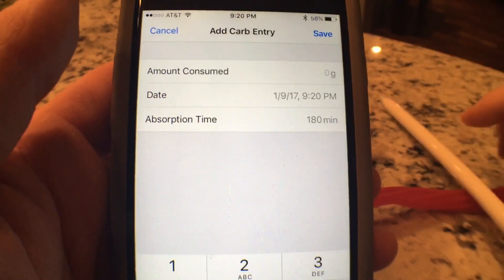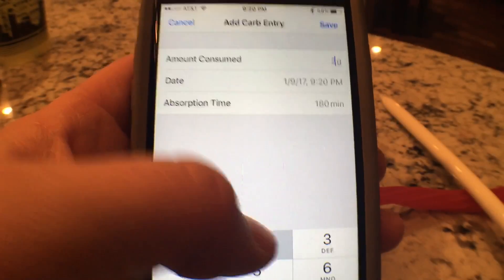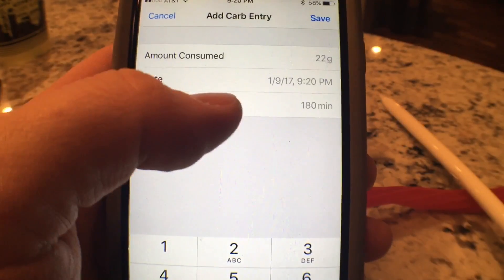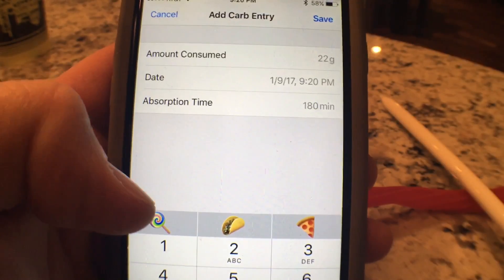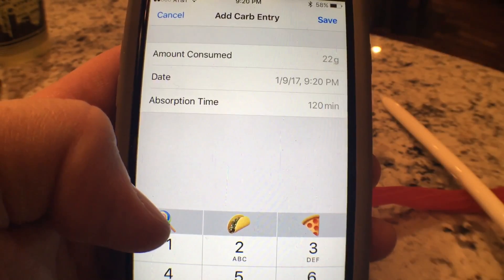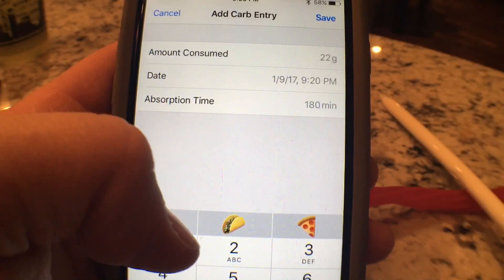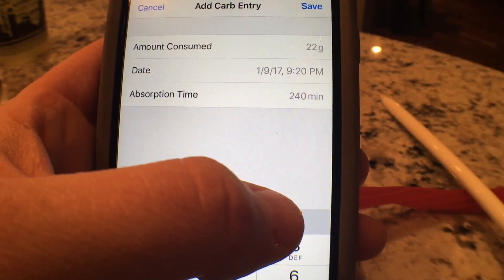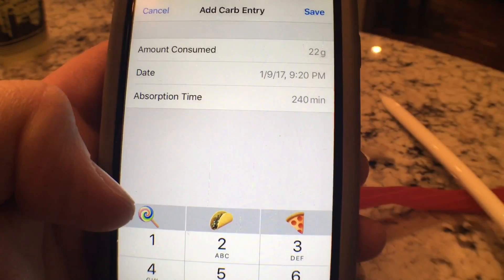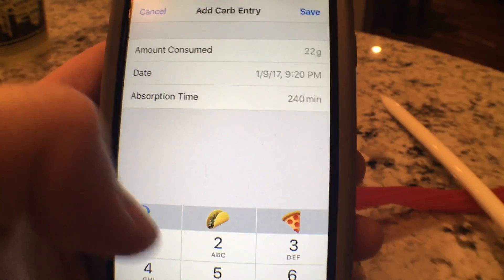This is where you enter carbohydrates. If I said I ate 22 grams of carbohydrates but I wanted to change the absorption time, you can say here's how long these carbs are going to be in your body. This is basically two hours, this is three hours, and that is four hours. So the higher fat content has four hours and the lower fat content has only two hours. You can put in whatever you want.